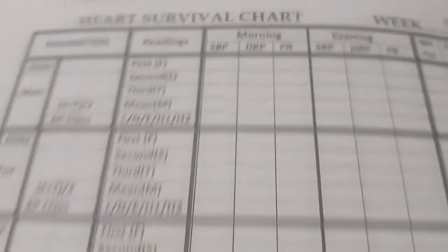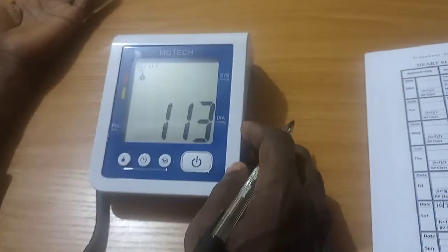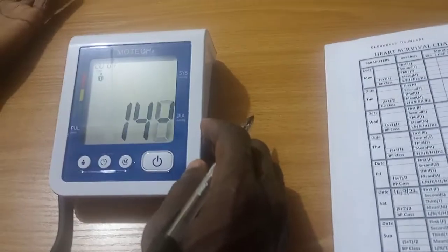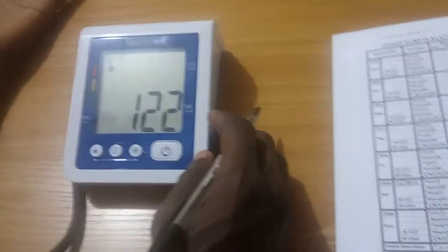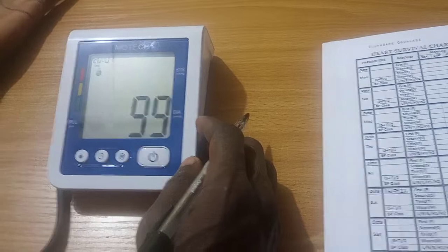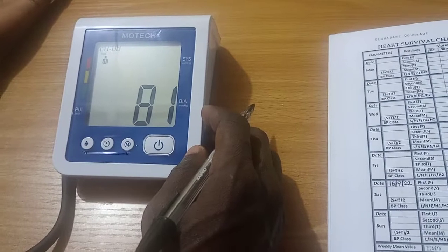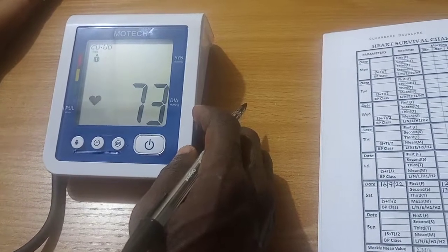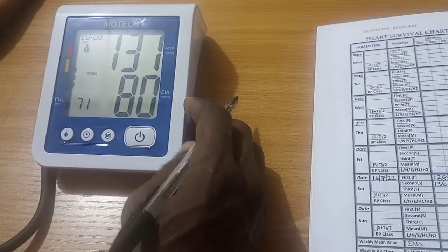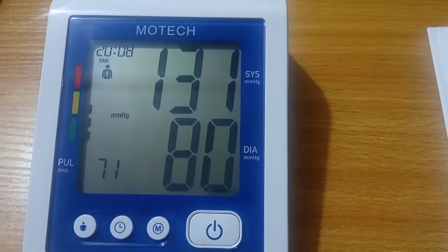The device is ready for use. You may start measuring. Third reading — Systolic: 131 mmHg. Diastolic: 80 mmHg. Heart rate: 71 beats per minute.